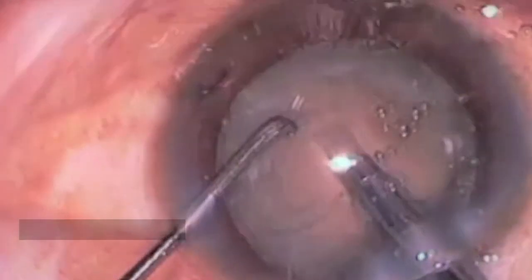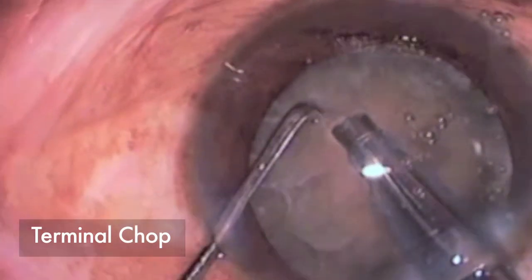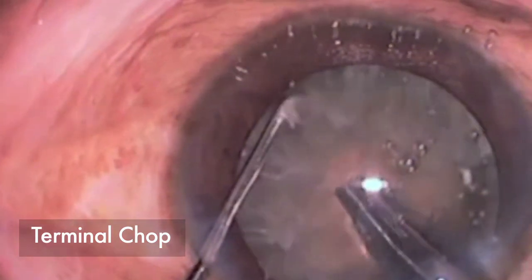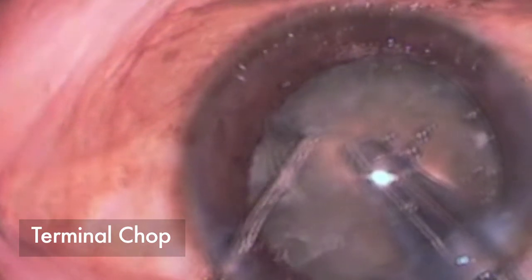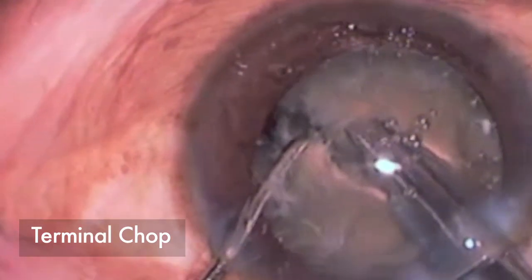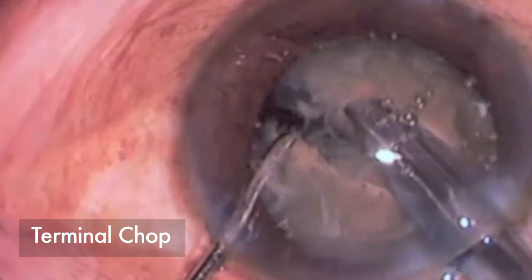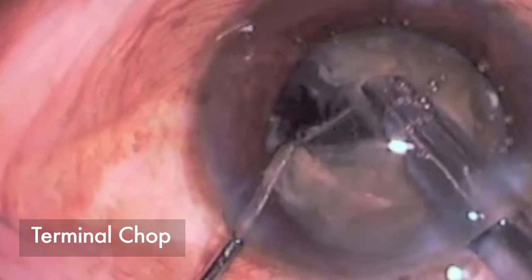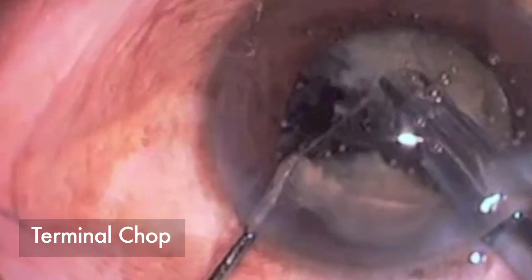To conclude, full-thickness nuclear segmentation is crucial in performing quick, safe and uneventful phacoemulsification in mature hard cataract. Complete nuclear segmentation achieved with terminal chop is extremely safe, as the dispersive forces are working away from the posterior capsule with least manipulation. Terminal chop is highly efficient, least traumatic, giving minimal stress on the zonules and posterior capsule while preserving the integrity of the endothelium and the uveal tissue.